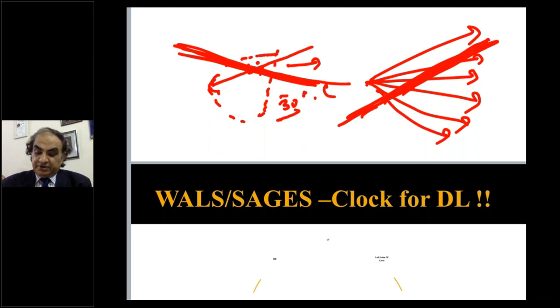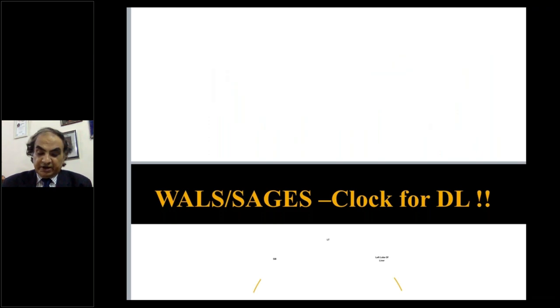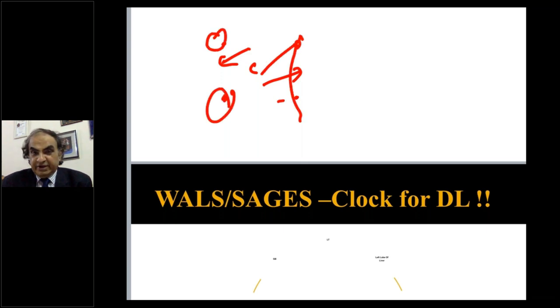The other thing, I'm repeating what I've already said, you will start with two ports. The other port would be, as I mentioned in the beginning, the left iliac fossa or the right iliac fossa for the lower part. Right hypochondrium or left hypochondrium for the upper part. Easy to remember. If I'm operating here, this port is going to be useful, so I'll use this. If I have to operate here, I'll use this port for working. So they're available to you in that form.